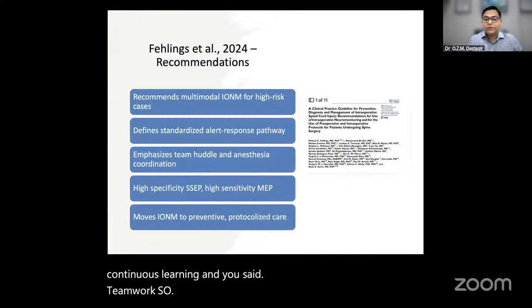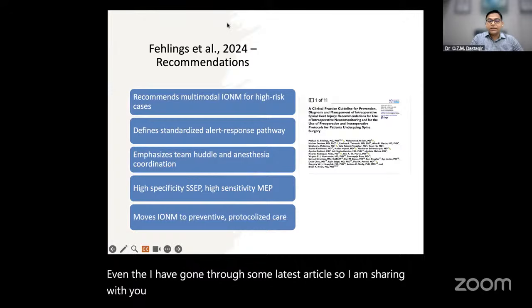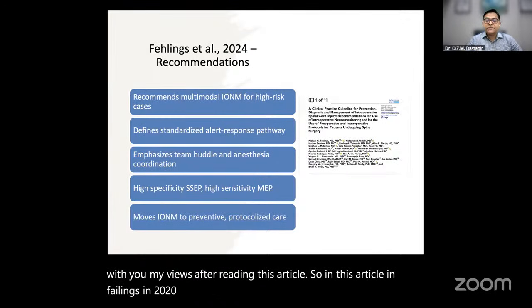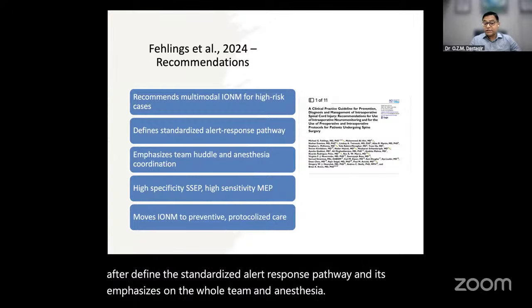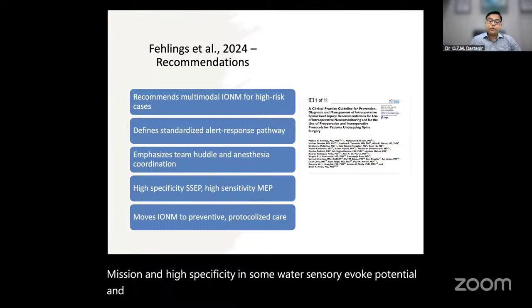I have gone through some of the latest articles, so I am sharing with you my views after reading this article. In this article, in Spine in 2024, their recommendation is multimodal monitoring for high-risk cases, a defined standardized alert response pathway, and it emphasizes whole-team and anesthesia coordination, high specificity of somatosensory evoked potentials, and high sensitivity of motor evoked potentials.